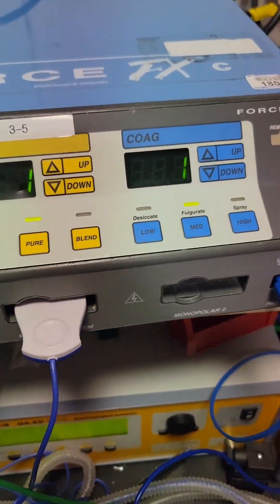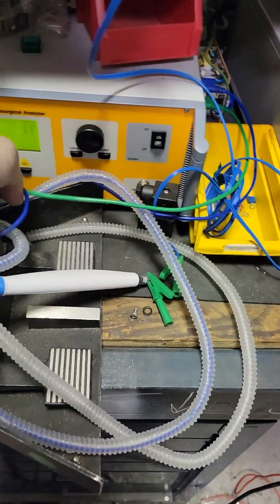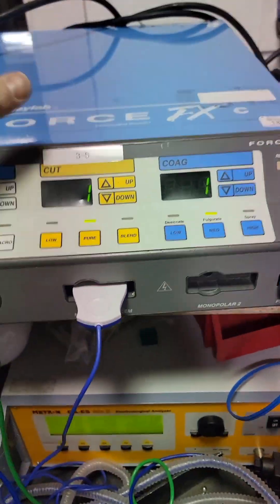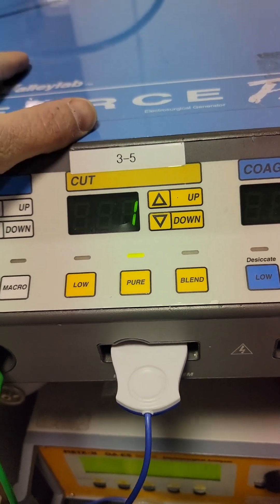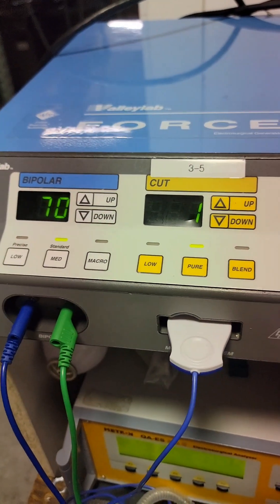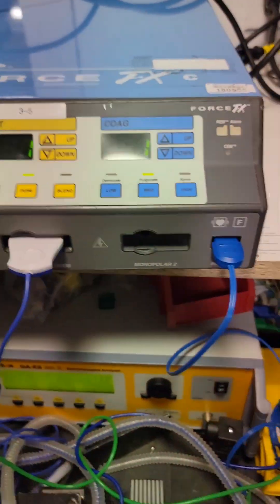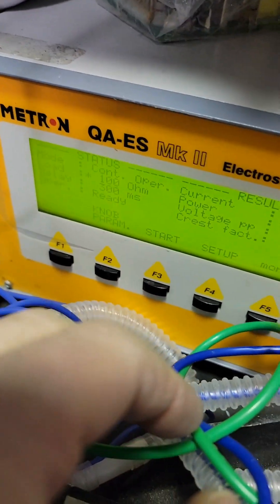Let's test bipolar first. I'm going to start off with higher numbers — let's go to the max, 70. We are all hooked up to my ESU analyzer. Every make, every model, every manufacturer has different specs on the load that you need to properly test and get the proper numbers. For this one, for the Valab line, bipolar only goes to 70. They want you to do tests at a 100 ohm load, so we have a 100 ohm load.